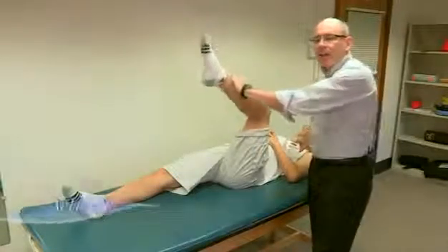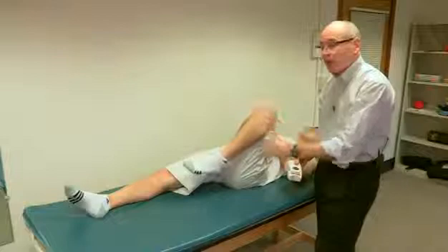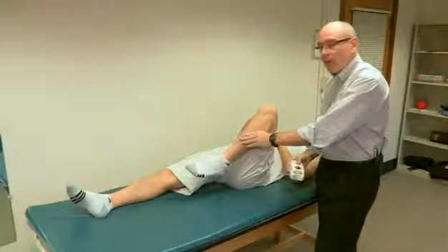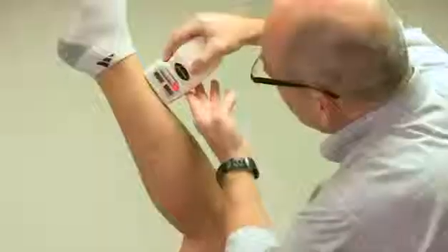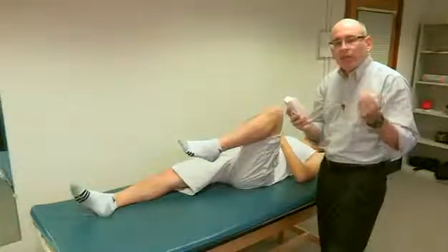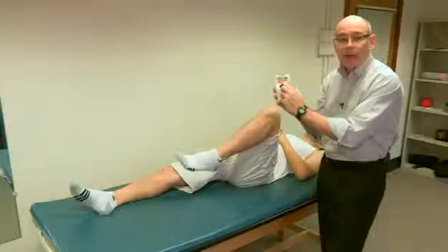Now we're going to do the active knee extension test. The presumption is that his thigh is vertical. In this case we're not measuring excursion — I want to know where he is relative to vertical when he straightens his knee as much as possible. I set it while his thigh is vertical. Straighten your knee as high as you can. I measure that position — it was 31 degrees from full extension. That is the measurement for his active knee extension test.